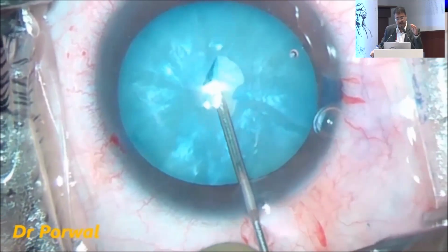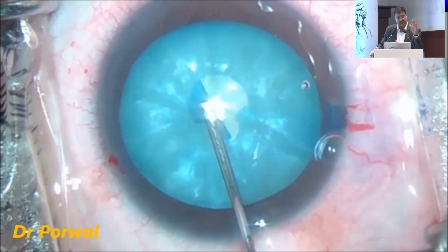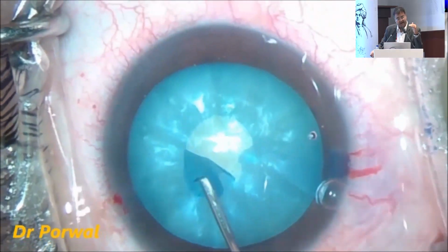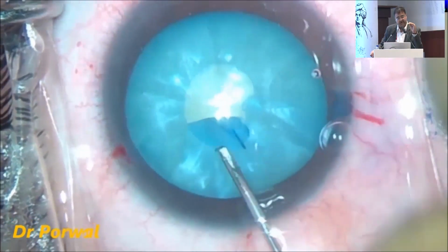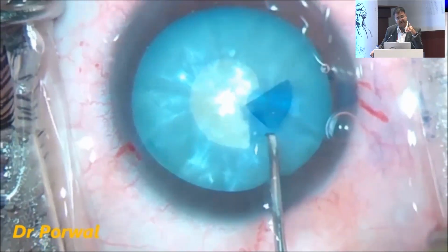Now put a cohesive viscoelastic. Again, you should not overfill the anterior chamber. It should be just adequately filled. Start with a small rhexis. Whenever you do these intumescent cataracts, always start with a small rhexis and then you can refashion it.